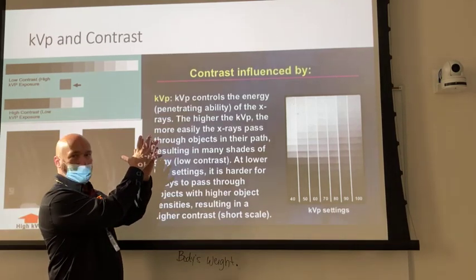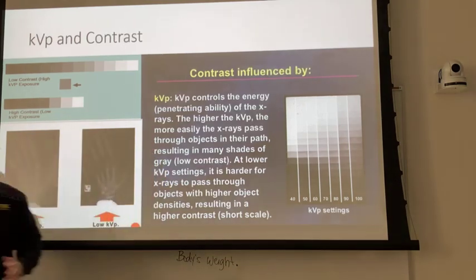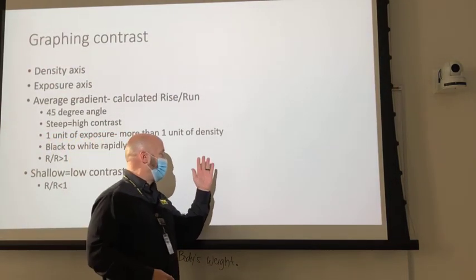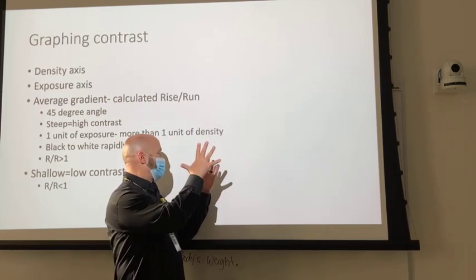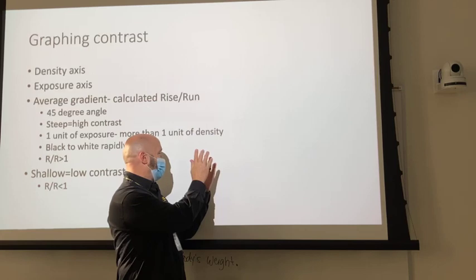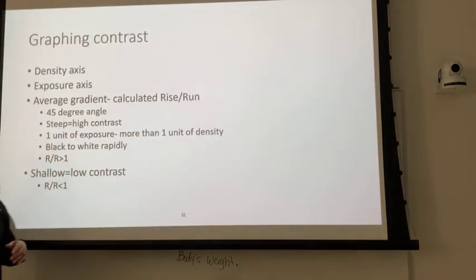Do they match? The answer is no. So the saved computer algorithm looks like this, yours looks like this, and what it's going to do is take yours and try to manipulate it. It does it a whole lot faster than I'm doing, so that they look almost identical as far as the contrast and density go.